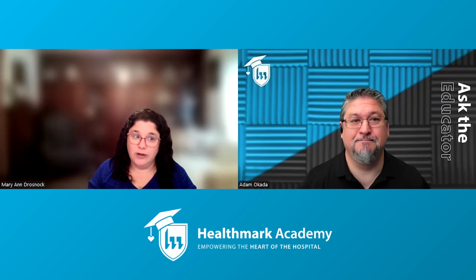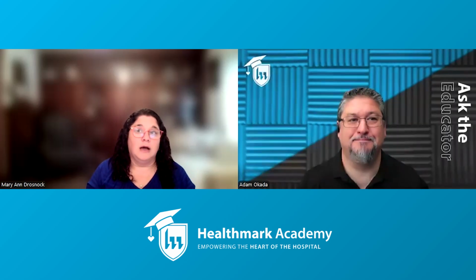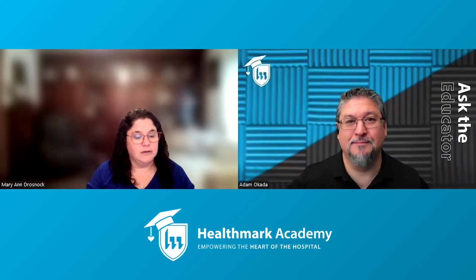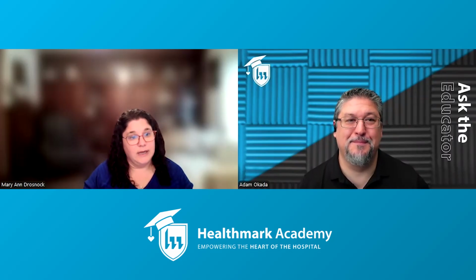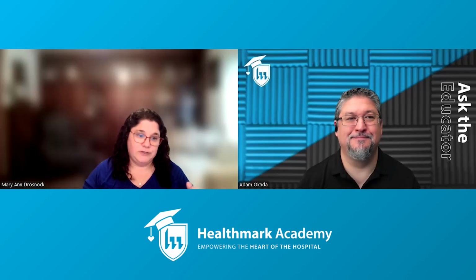That's serious to me, because we already know we have an issue with duodenoscopes, and the original post-market safety surveillance cultures that were mandated by the FDA showed that there was, on average, somewhere around a 5% contamination rate with high concern organisms on these scopes to begin with. And then if you add in a longer delay, it's even worse. So they've eliminated that allowance for time in there.